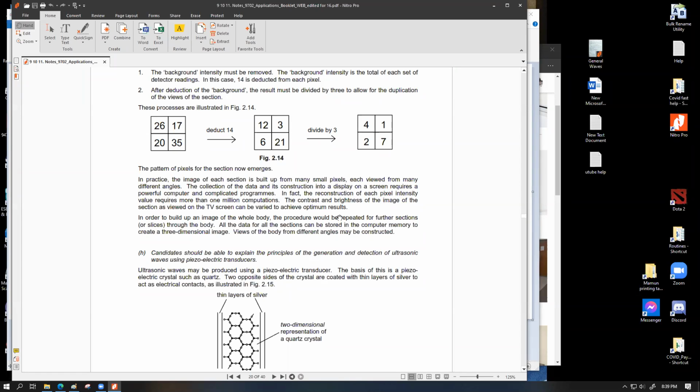So we would know, and depending upon how much absorption we have, we can also consider, is this a certain crystal? For example, you can have crystals grown in the kidney. Kidney stones are actually physical stones. They are the accumulation of some sort of carbonates and sulfates together, which gives rise to crystals. Gallbladder stones are actual stones too, but the physical tumor is basically human tissue. So you have different ranges of absorption behavior for different types of anomalies, and from those anomalies, doctors can predict what is there and at precisely which location, and we can go on to make that diagnosis.